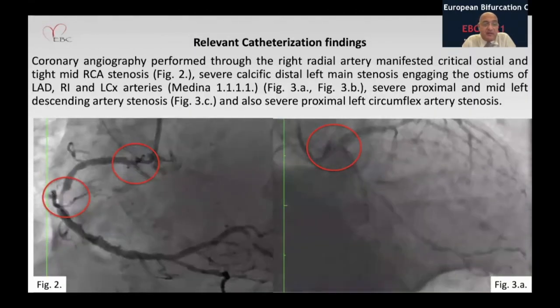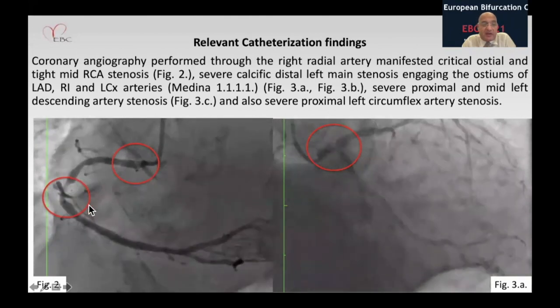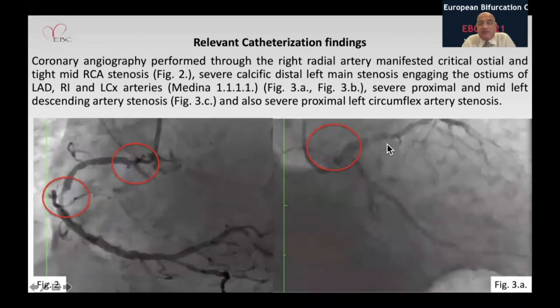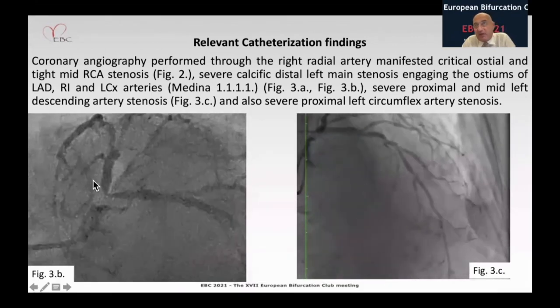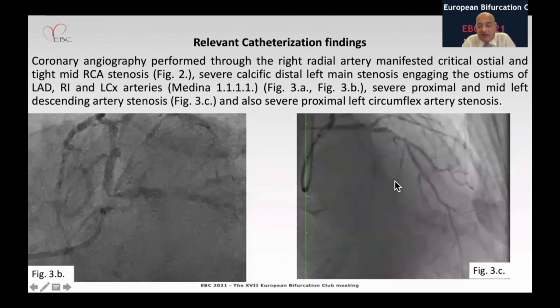The next day, angiography demonstrated ostial stenosis of the right coronary artery and stenosis of the mid segment, and severe stenosis of the left main and circumflex and proximal to mid LAD. Here we can see the situation with the left main. I think it's a really dramatic situation with the left main and also the mid LAD.